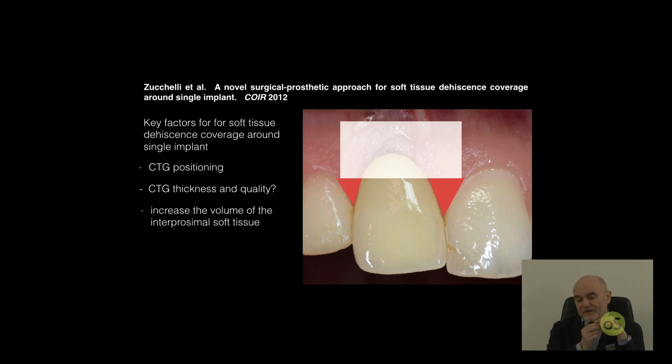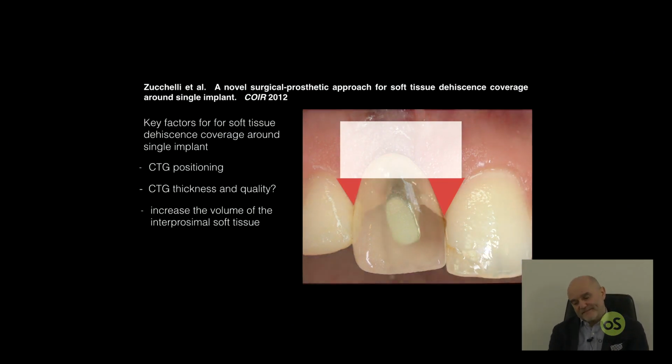Obviously, if you remove the crown and if you change the abutment so that the old abutment is substituted by a surgical abutment that is so thin, so narrow, that much more space can be left from the two adjacent teeth, with such a very thin abutment you can leave the soft tissue that was squeezed by the crown to fill back this space that is now left available for the soft tissue.